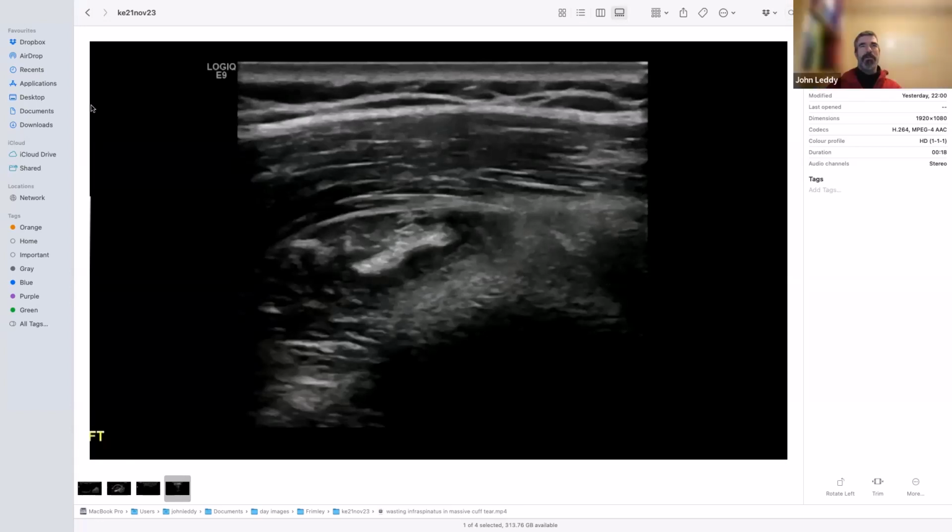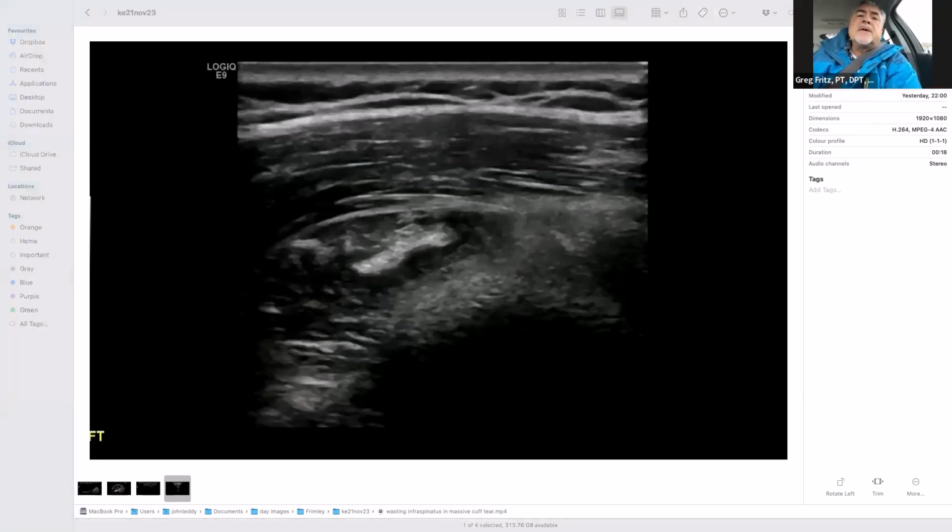I love that. I scan all three of those as a routine on all of my scans, primarily because I believe I can gather a lot of information as to how healthy the muscle is simply based on its reflectivity. You can verify whether or not a tear has really affected performance if you don't see fatty infiltration.